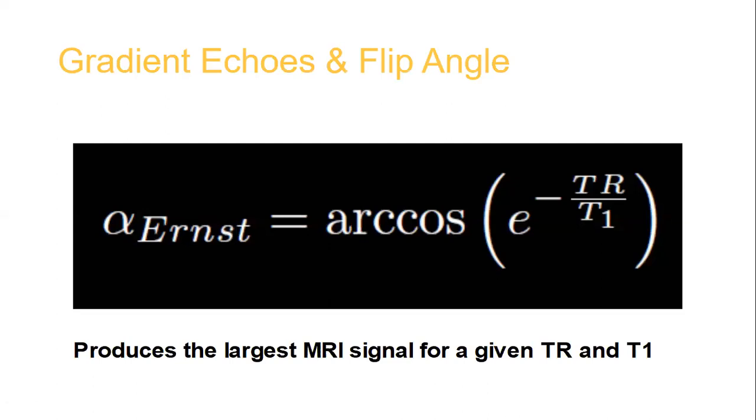Then in the gradient echo, the flip angle is about the most important discriminating factor. Being able to get the right flip angle for any application is key to understanding gradient echo, because the image we capture with a flip angle of 90 degrees will be different from that captured with 2 degrees, 5 degrees, and so on and so forth.